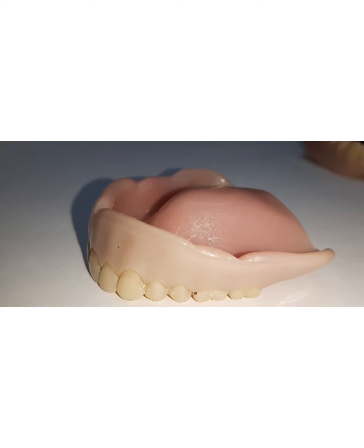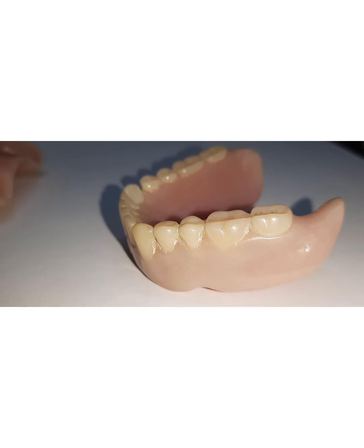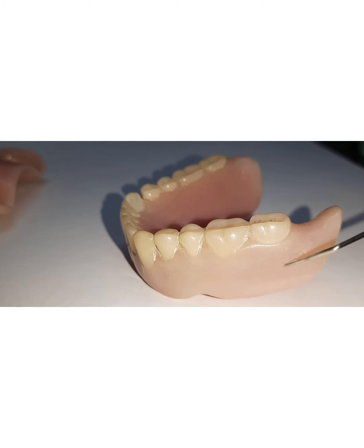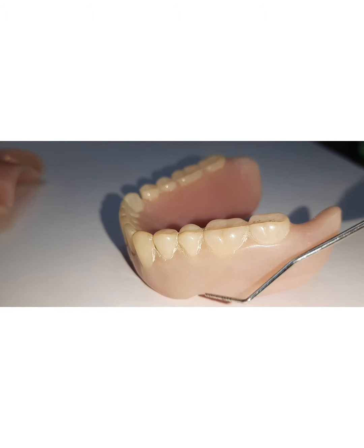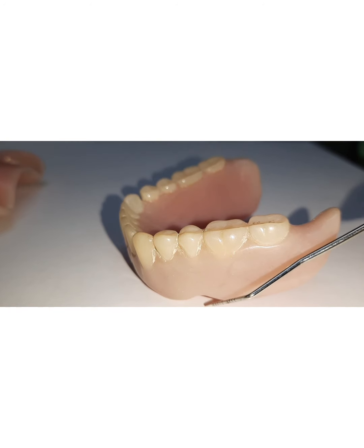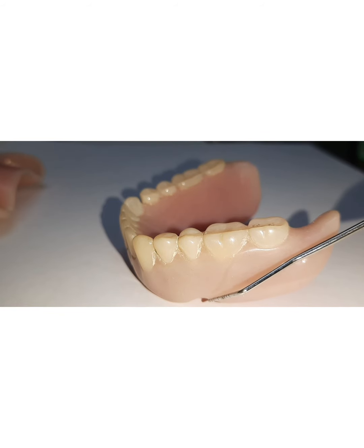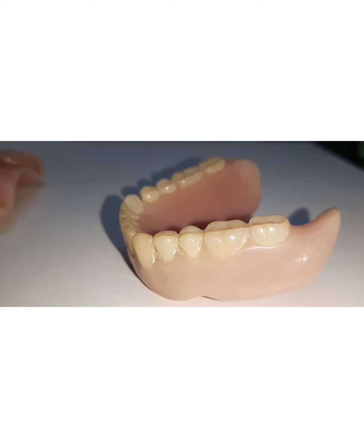Next is the buccal flange, which provides support to the cheeks, and they occupy the buccal vestibule of the mouth. In the lower denture, the buccal flange transfers the occlusal forces to the buccal shelf region. Now, why this region? Because this is the primary stress bearing area in the lower arch. And here, you have the buccal frenum, which is attached here, having active muscle fibers, and therefore we should provide additional relief in this region.